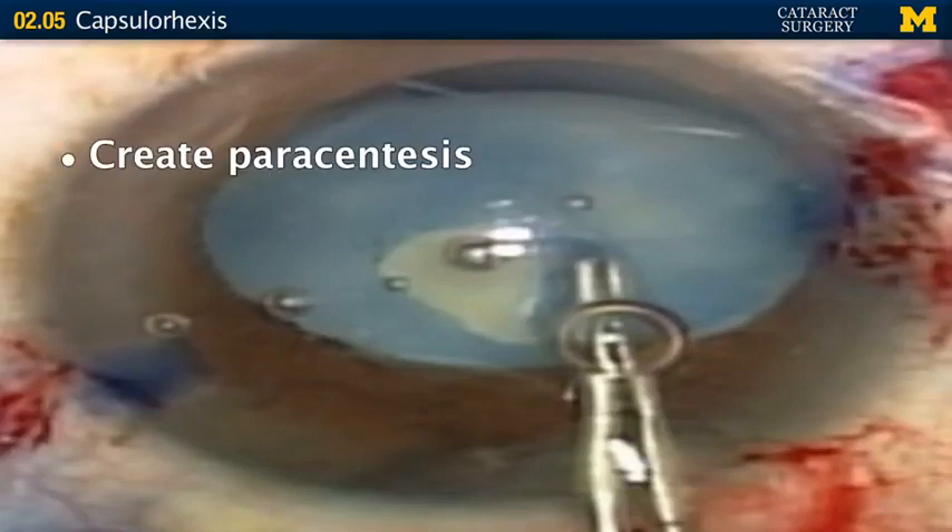Sometimes you won't be able to see a red reflex because the cataract is really dense — like a completely opaque white cortical cataract. In that case, you'll need to use a special stain to make it obvious where your capsule is. Special stains are used to visualize the anterior capsule when the cataract is completely opacified and you can't use the red reflex.